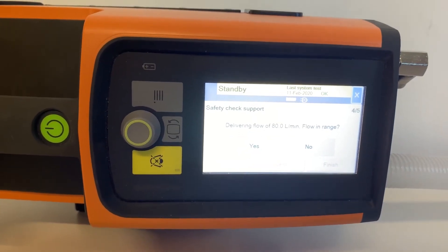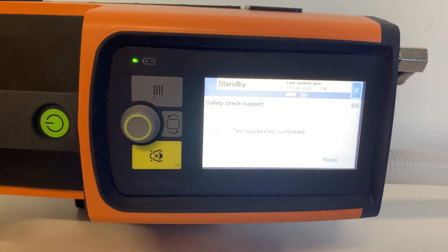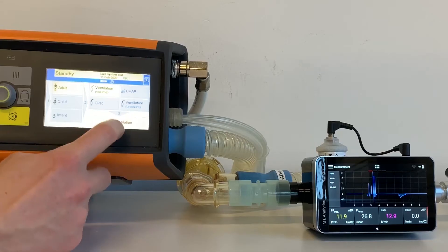Check the delivering flow of 80 L per minute. Is the flow in range? Tap Yes. Test successfully completed. Tap Finish. Next measurement is Comparative Measurement.